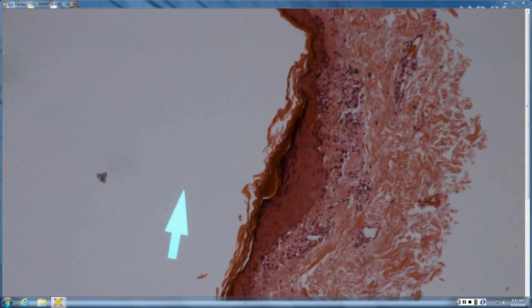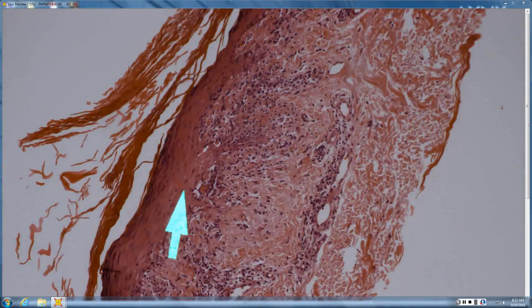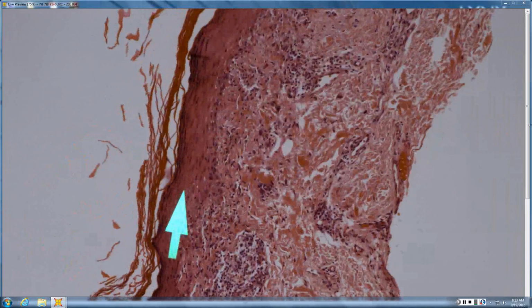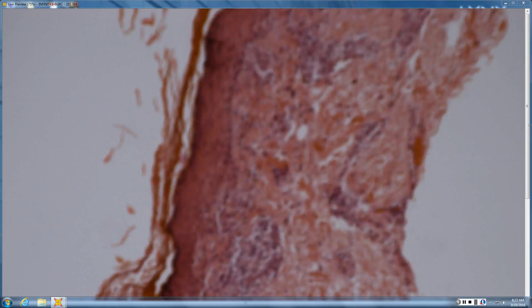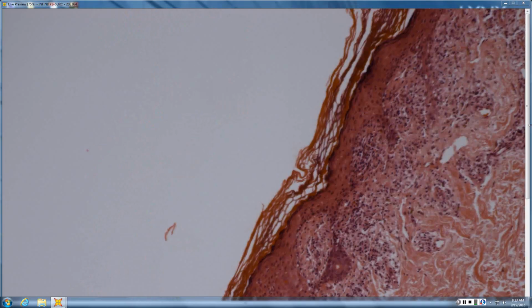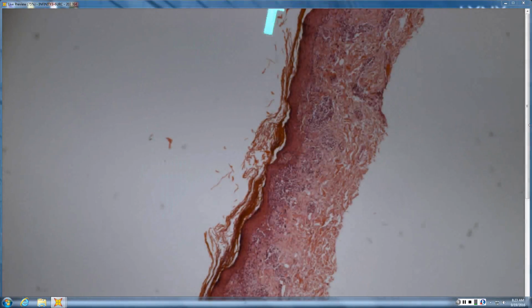So this looks like a shave with some interface. So vacuolar, or are they sawtooth with some Civatte bodies? The latter. So probably more lichenoid interface. Tell me about your corneum. Is it the same here and there, or is it different here and there? It's different. So probably if the history's right, that would be a nice clue.